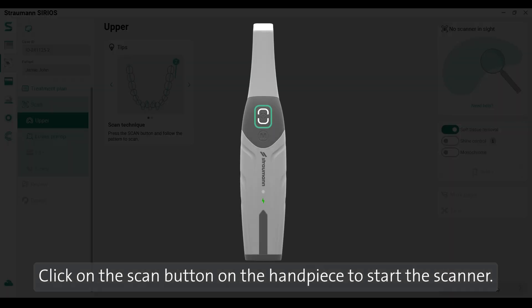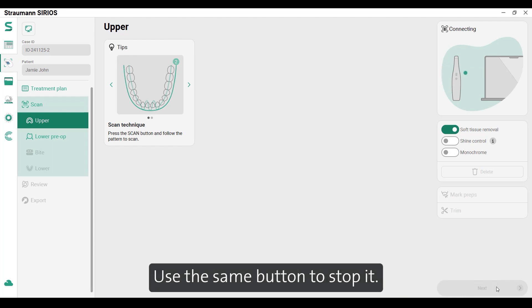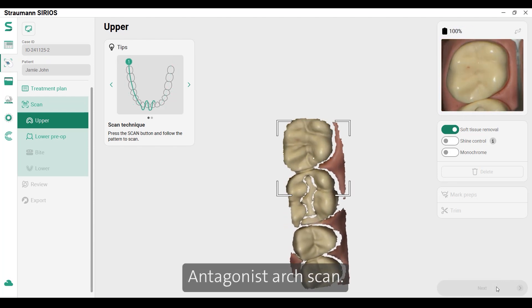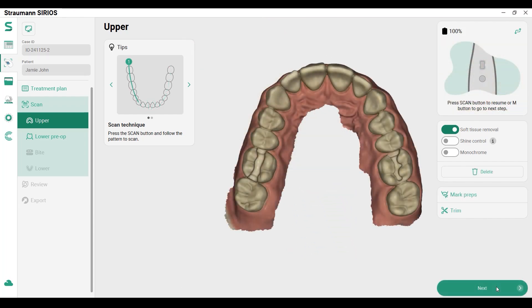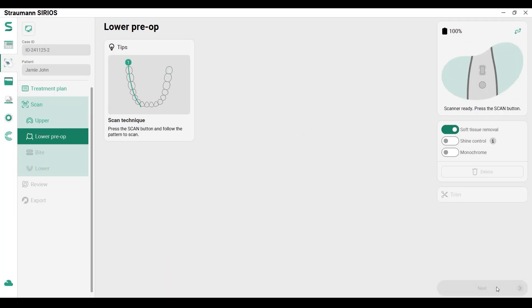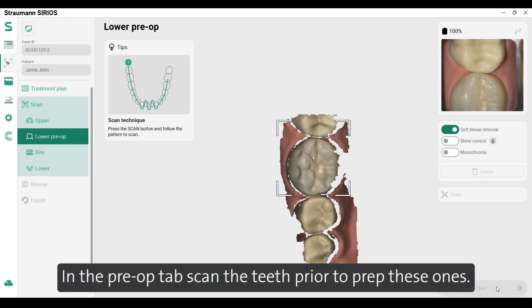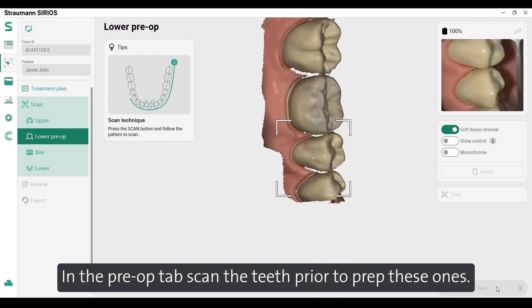Click on the scan button on the handpiece to start the scanner. Use the same button to stop it. For the antagonist arch scan, use the M button on the handpiece to move to the next screen.